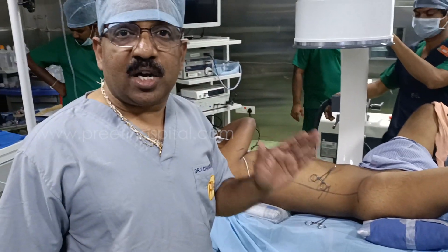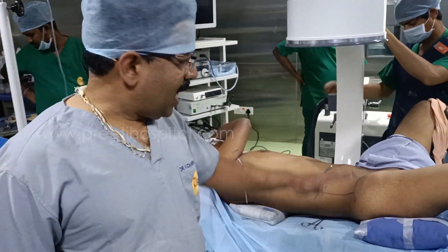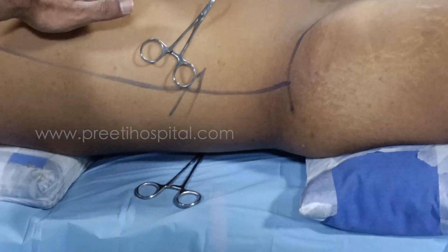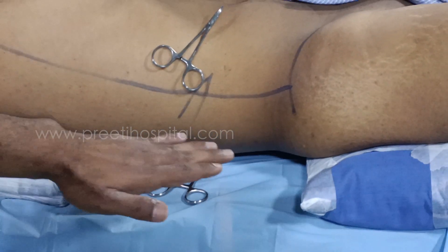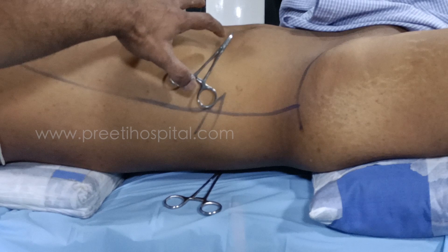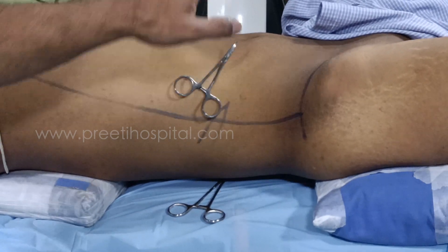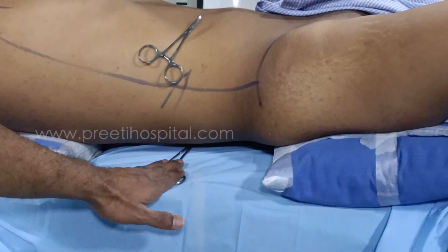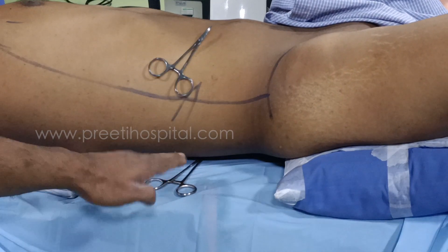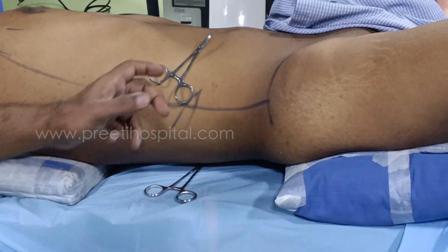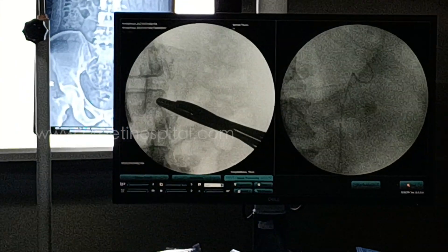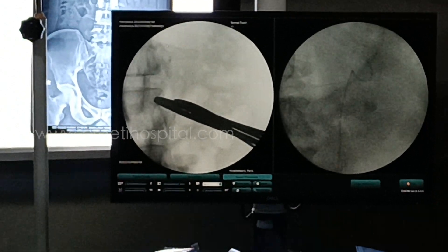Interpretation of anterior and posterior in supine PCNL: imagine one needle is anterior to the stone, one needle is posterior to the stone, both are at the same level. If you see at 0 degrees, they are at the same level.